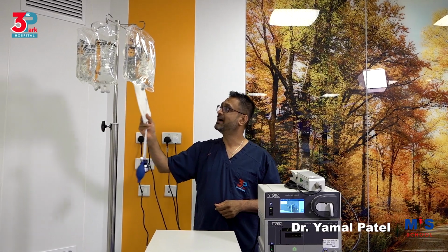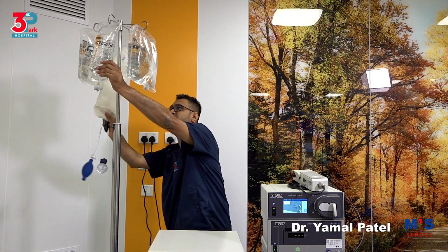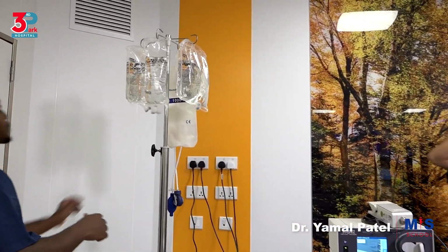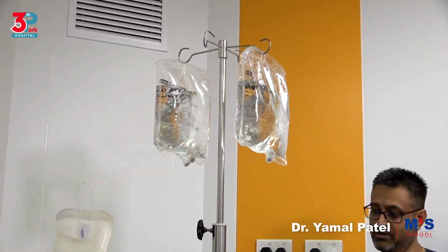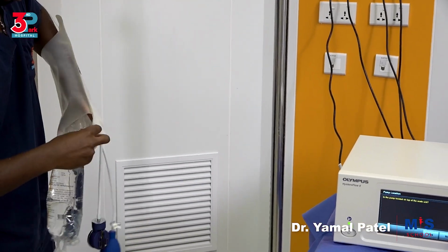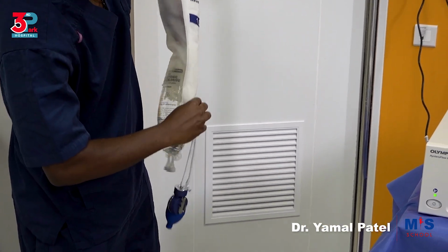The next one you have is with a pressure bag. So you can have this pressure bag to connect and put inside the tube. He'll show you how we'll do it. So that's one other option, the pressure bag. And with that, you have the pressure that can be created in this bag to deliver the fluid a little bit under pressure.